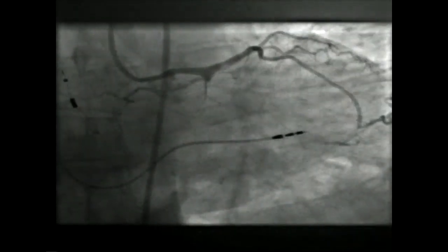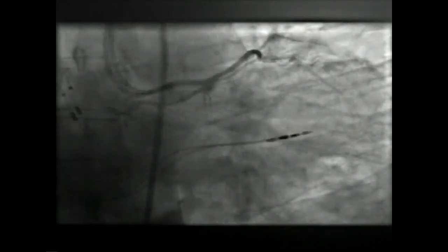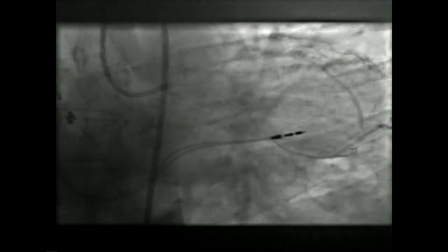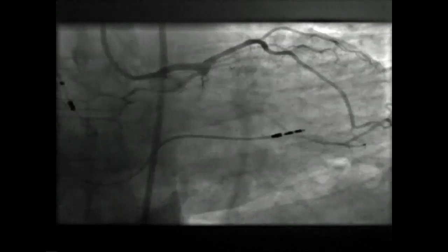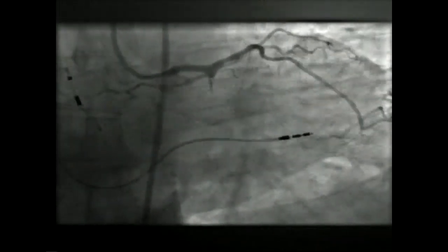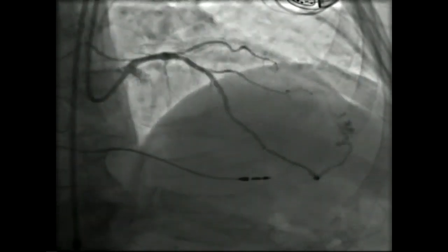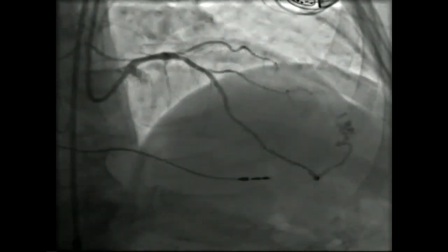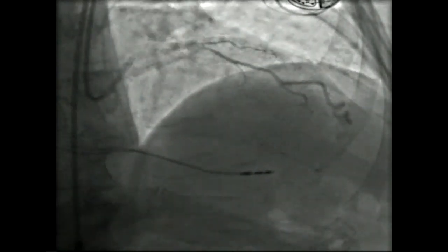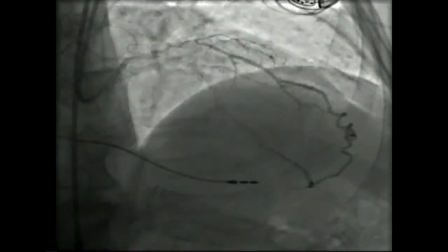Starting with a case — this is actually a CTO case. You can see a proximal blunt cap on a circumflex that's already been attempted elsewhere, and you don't have a lot of distance to get a wire down. If you're going to go anterograde, you're going to need a more supportive microcatheter typically. This case was referred specifically to consider retrograde, and you can see a terribly tortuous epicardial from an LAD to the circumflex, so you're going to have to pick a very different microcatheter for something more tortuous. Fortunately, they've made the catheters much better.